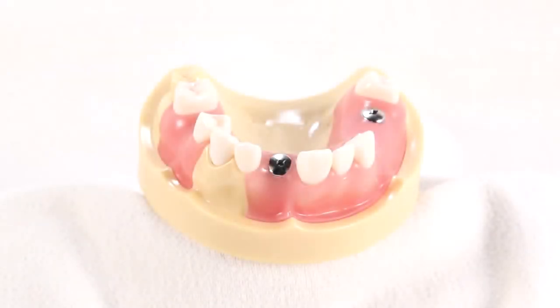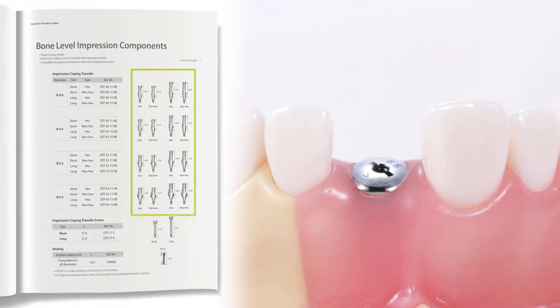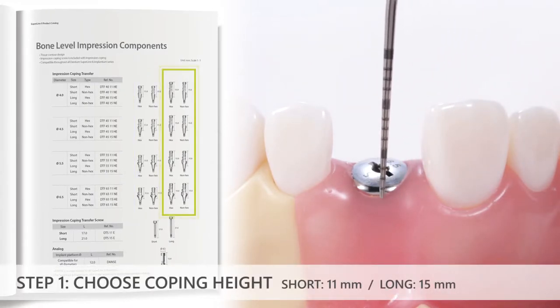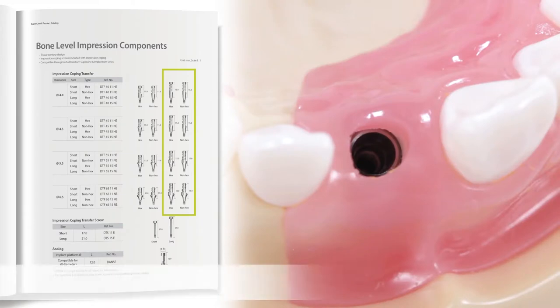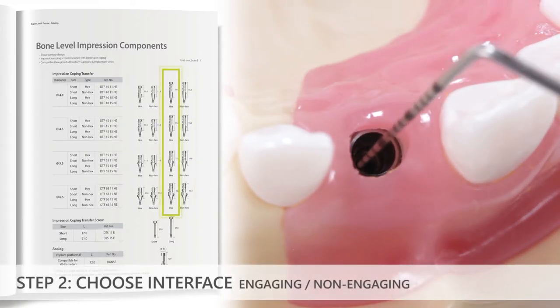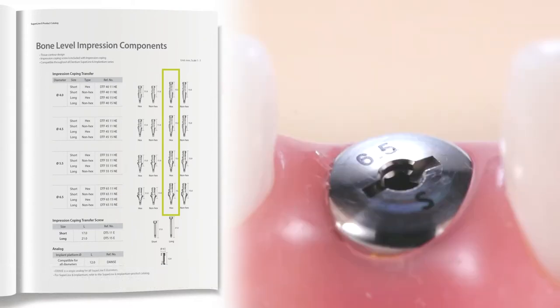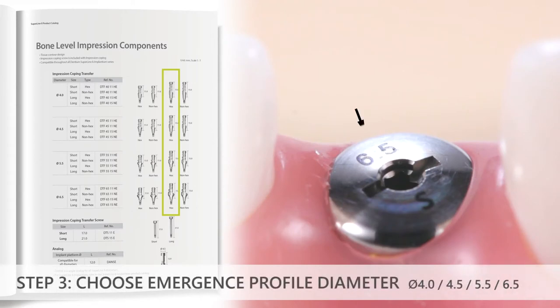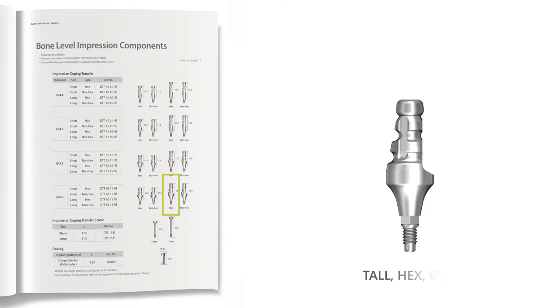For this video demonstration, an implant level impression of site number 9 will be made. The decision-making process for the selection of the closed tray impression coping proceeds as follows. First, for coping height, a tall coping will be chosen to match the cervico-incisal heights of the adjacent teeth. Second, for the interface, a hexed or engaging interface will be chosen so that implant timing can be recorded for the single tooth restoration. Third, for the diameter, the surgeon placed a 6.5 mm diameter healing abutment, so a tall, hexed 6.5 mm diameter impression coping could be chosen.